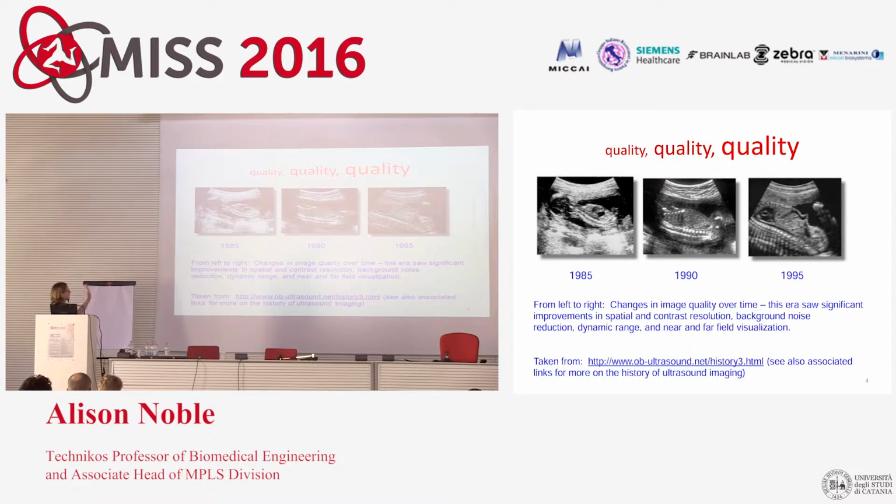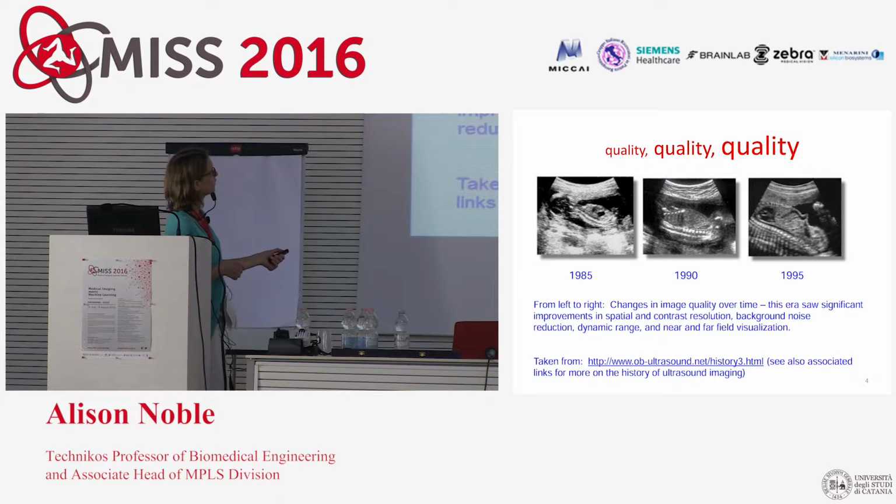You go from 1985, 1990, 1995, and what you're seeing here are fetal ultrasound scans. This is the fetus, there's the head there. The structure down the back, which you can hardly make out here, is the fetal spine. You see the change in definition of this over a relatively short period of time.